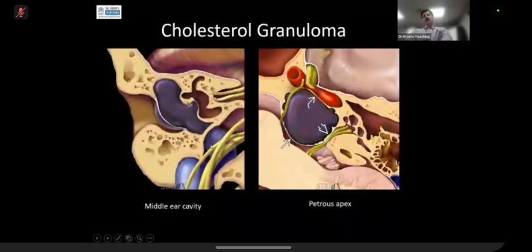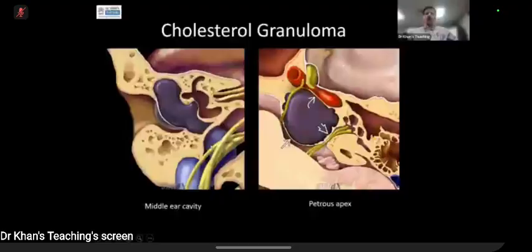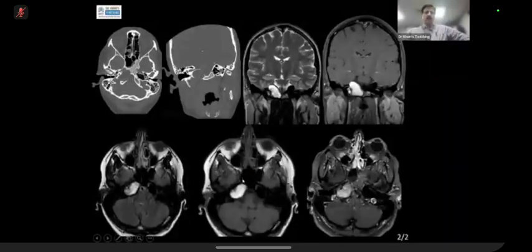Now, what happens is that it keeps bleeding within the lesion, and so part of the high signal is hemorrhage. Part of it is cholesterol crystals. That is the concept, and it will cause expansion. So it's a unique type of chronic inflammation. The radiology is Aunt Minnie radiology, and it will cause expansion. On a T1 weighted sequence it will show you high signal, partly because of methemoglobin and maybe because of cholesterol. Mostly it is because of methemoglobin.